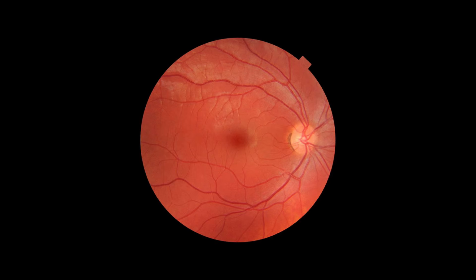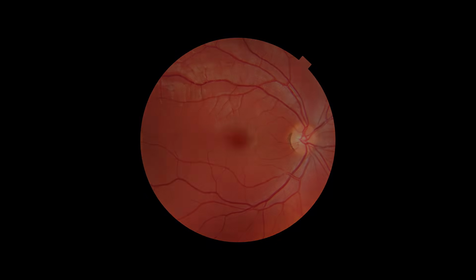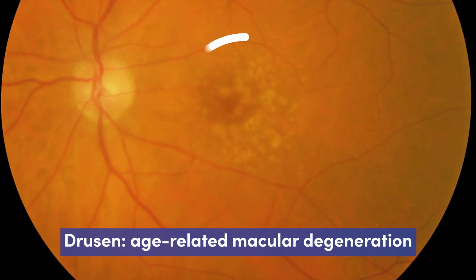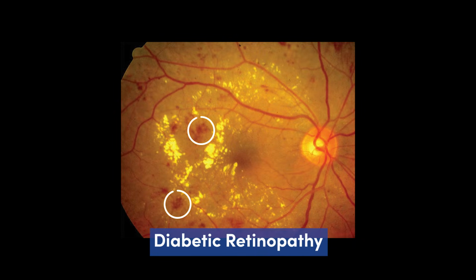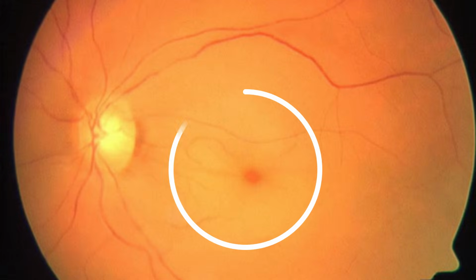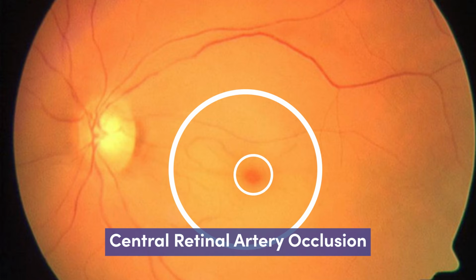The normal macula has a dark orange or reddish appearance. Within this, look for yellow deposits known as Drusen, which are seen in age-related macular degeneration. In patients with diabetes, look for hemorrhages and hard exudates. And in patients with sudden painless loss of vision, look for a pale whitish macula with a very red center known as a cherry red spot, which is caused by a retinal artery occlusion.